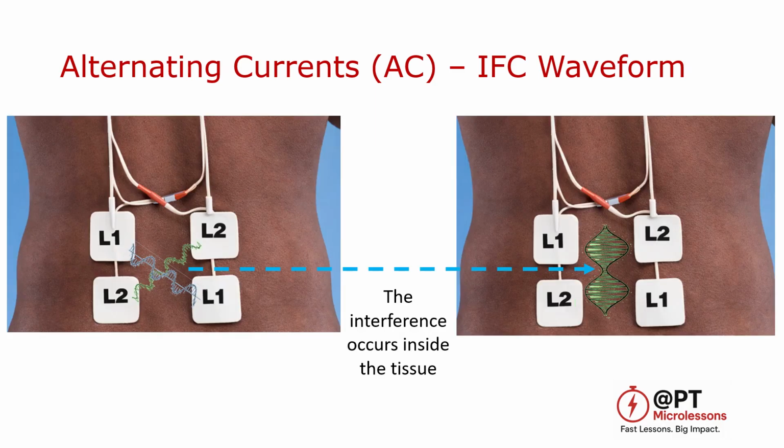This image shows how interferential current, or IFC, is applied using an electrode setup that is crisscross, or X pattern. One channel is labeled L1 and the other is L2. Each channel delivers its own carrier frequency. Then, these two currents travel through the tissue in different directions and intersect. At that point of intersection, the beat frequency is created within the tissue. This central area is the target treatment zone, where the patient experiences the stimulation. And this is why we cross the channels with IFC, to ensure the currents intersect and create the desired effect.